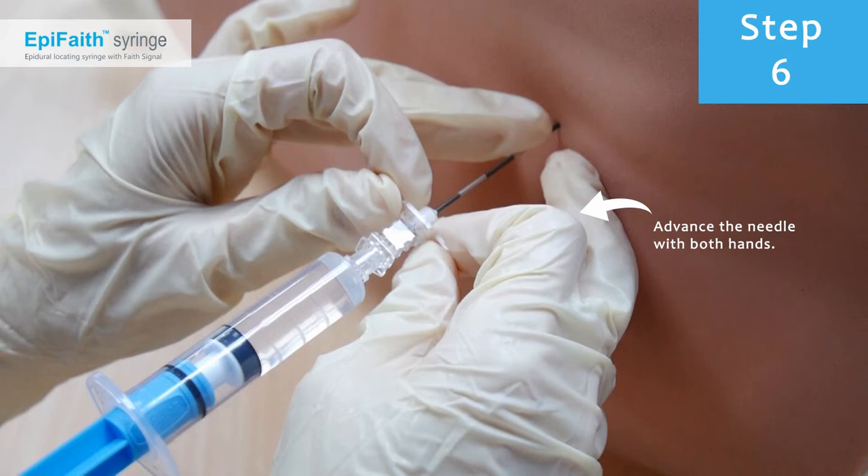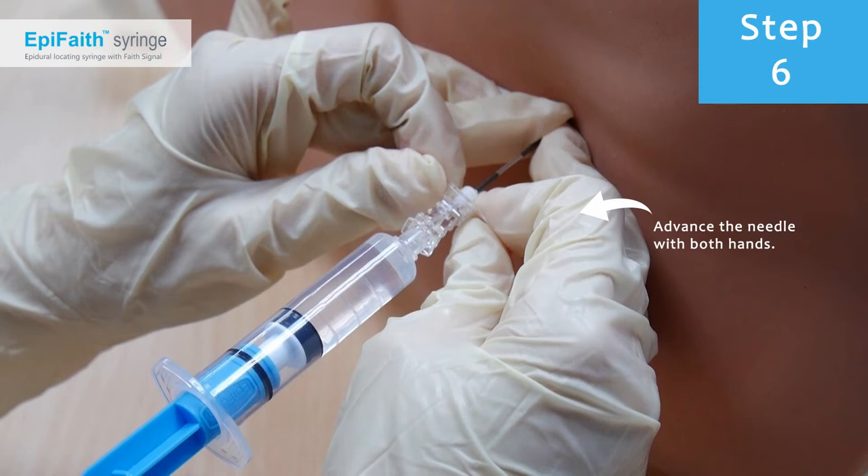Advance the needle. The fixator frees the user from having to hold the plunger during advancement. Using both hands to control the needle is recommended.